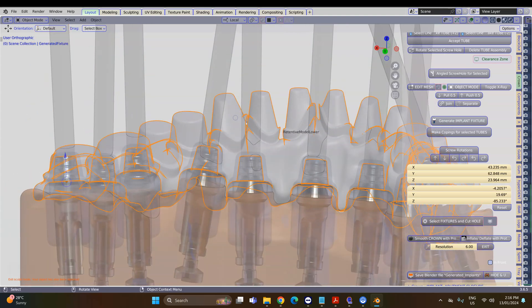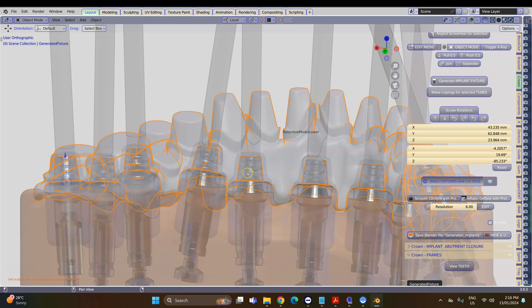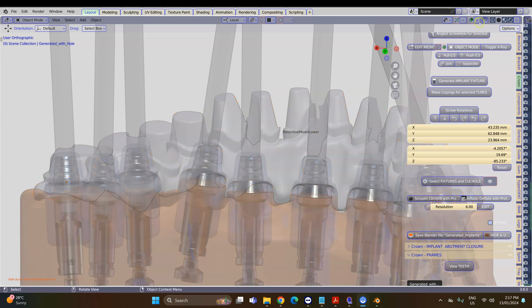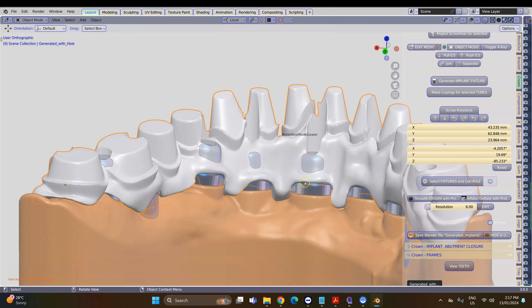Select it and then select Fixtures and Cut Hole. Please be patient while it's doing its work. Get out of transparent mode and then analyze your work.